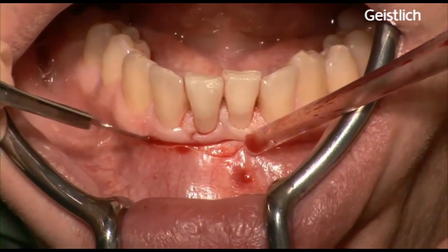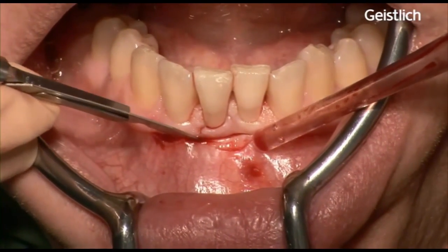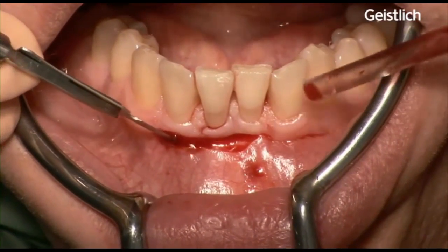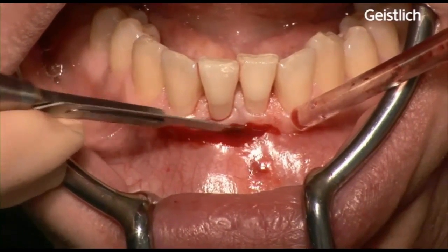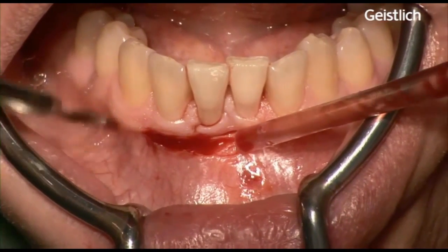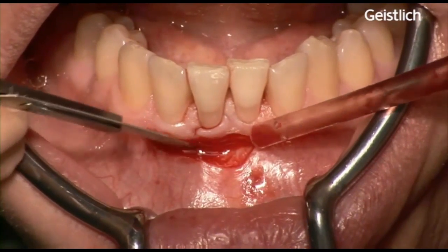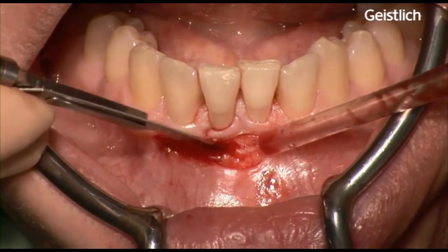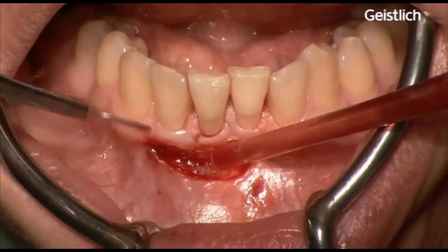A split thickness flap is prepared and care has to be taken not to cut through the periosteum. We proceed downwards until it is possible to move the flap passively in an apical position. To permit the apical advancement of the flap, eventually, some muscle insertions have to be eliminated.